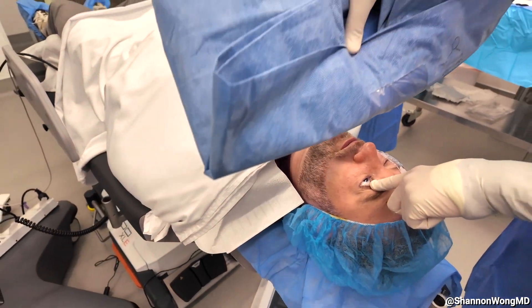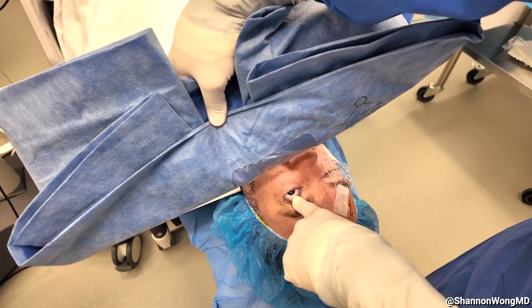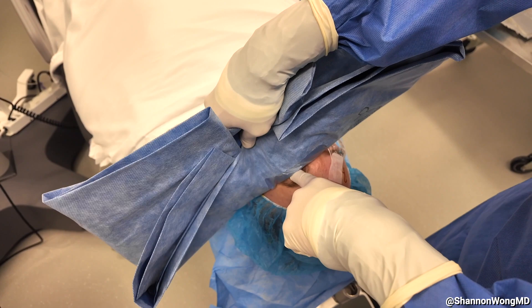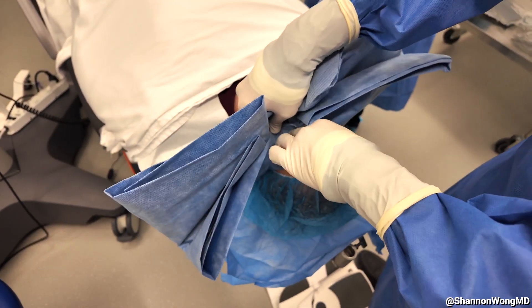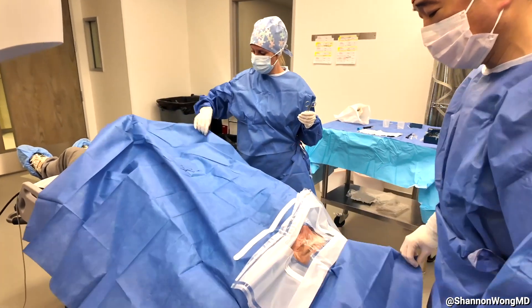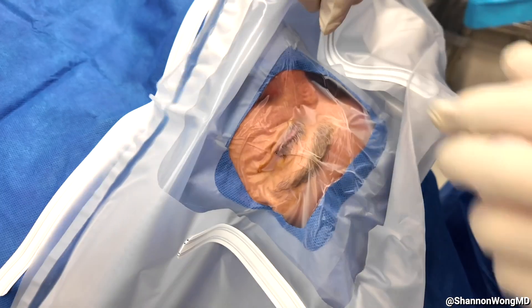Then we use one finger to hold and elevate the upper eyelid while we hold our drape with our other hand. While the patient is looking in primary gaze, we place the sticky drape right over the patient's eye, then apply pressure to make sure that the eyelashes are positioned up against the upper eyelid. Then we open the drape and visualize the lashes to make sure we have a good seal of the upper eyelashes.